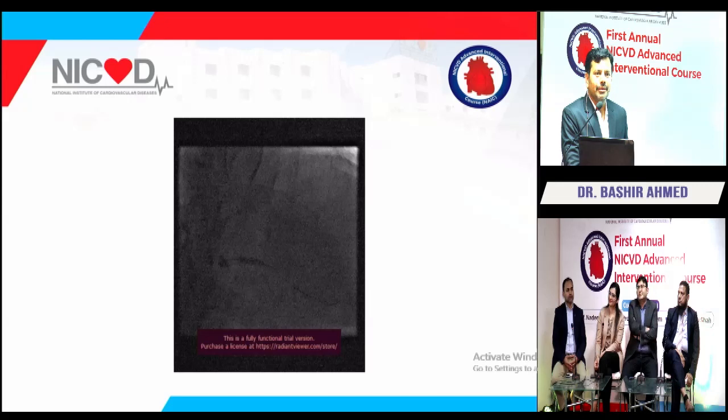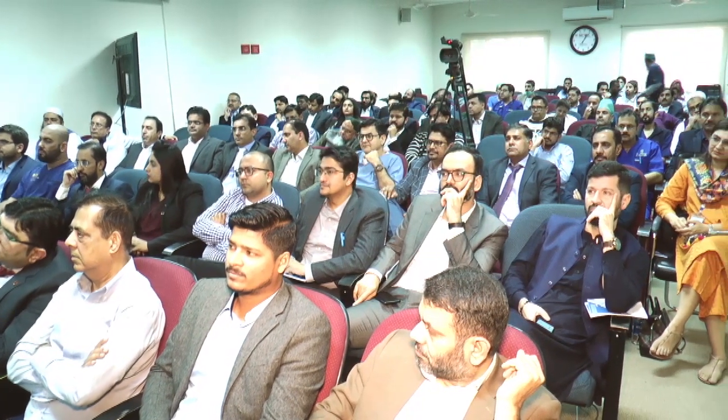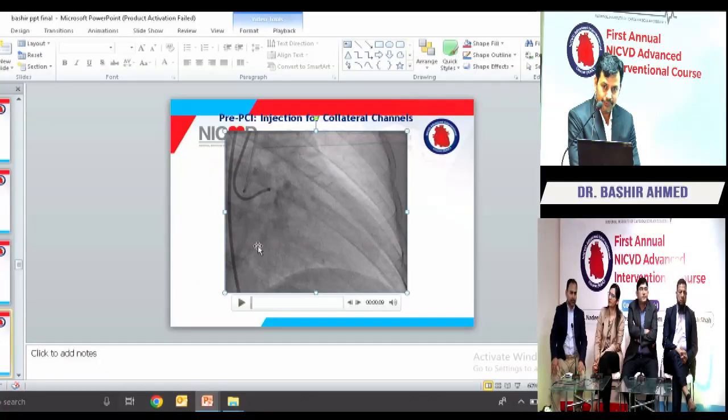So with microcatheter support we took Pilot 50 and successfully crossed the lesion. So can we proceed in this patient antegrade or retrograde? You should go antegrade first, antegrade first.